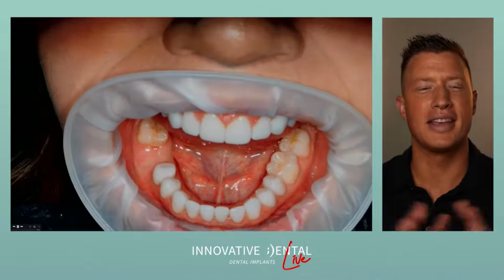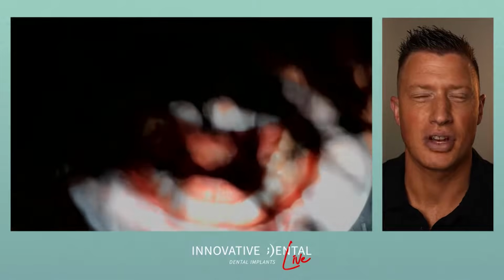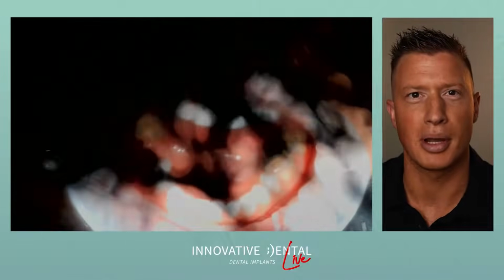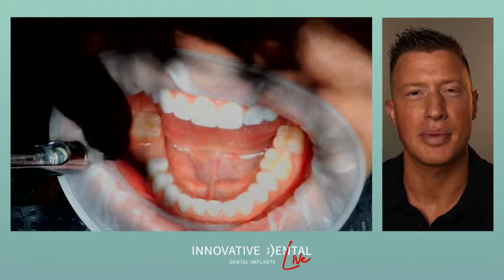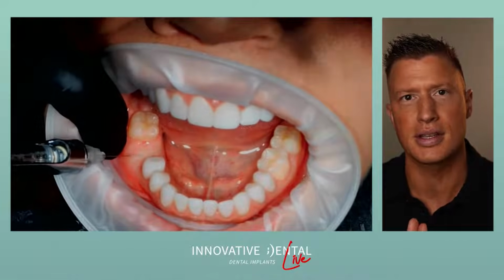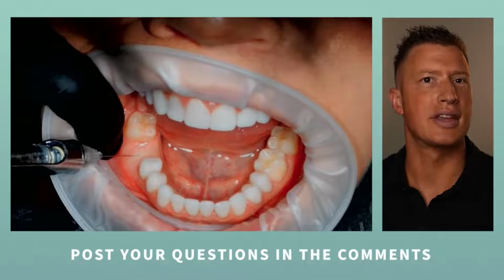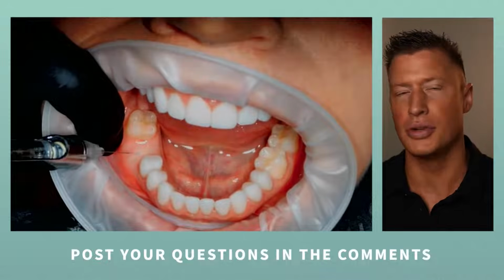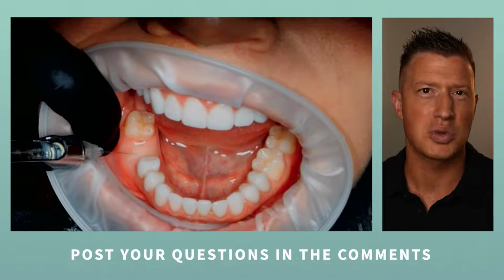Here we are. We're placing the implant guide. This is on my wife's lower right. Sorry about the hair getting in the way, but we're going to go ahead and give some anesthetic. Now, what's really slick about dental implants, they don't really cause pain in the bone. And so we don't need to go to the full extent of numbing up like we do for an extraction. We can really just make sure that the gums are numb, and that's what I'm doing right here.